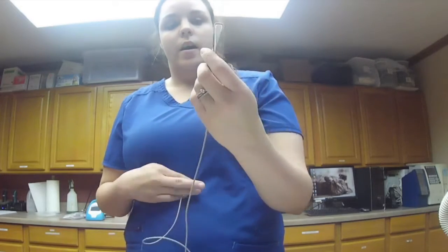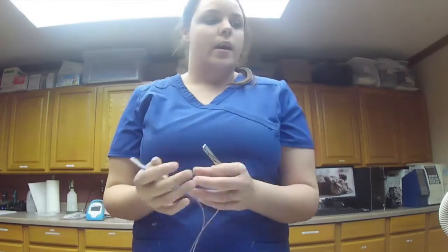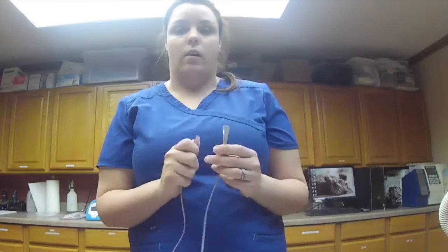They are labeled left and right, and you attach it to the front armpit of the dog and then spray with alcohol. An esophagus stethoscope, our clinic does not have one, but what you do is insert it into the dog and you can have it amplified through the room, or one person can have an earpiece and only hear it. But if you amplify it through the room, everybody can hear it, the doctor can hear it, and you can monitor that way.